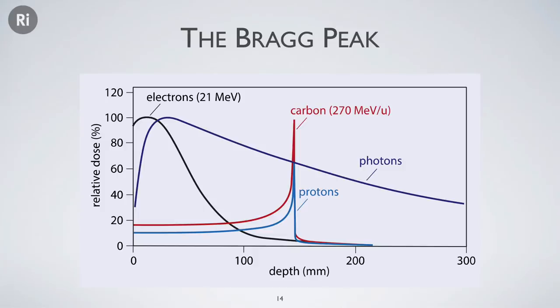However, if you use protons, which come from subatomic nuclei, they're the nucleus of a hydrogen atom, protons are heavy and they're charged. And rather than passing straight through and then every so often making a collision with an electron, which is what X-rays do, this big fat proton will rattle. Only slightly, it will see all of the electrons as it's passing through all of the tissue in the body. And you get these little glancing collisions, bump, bump, bump, as it's going through.